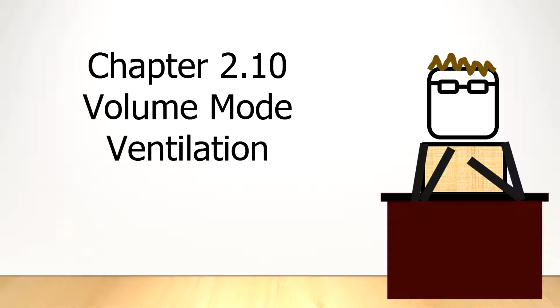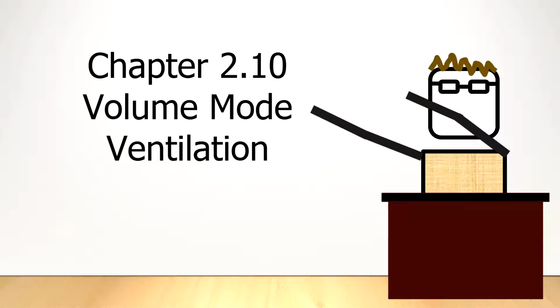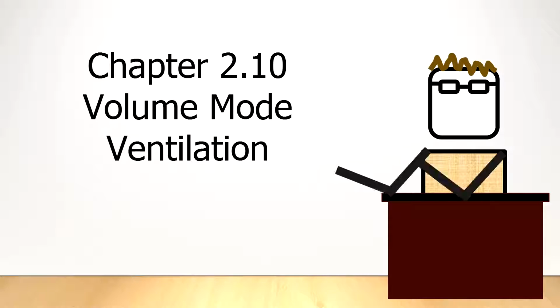Welcome to A Basic Introduction to Mechanical Ventilation. This is Chapter 2.10, Volume Modes of Ventilation.